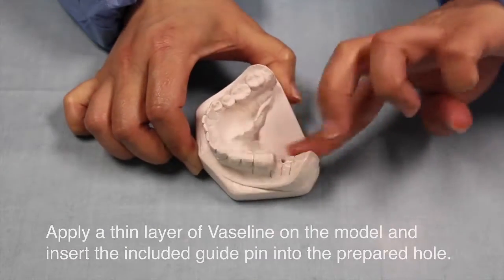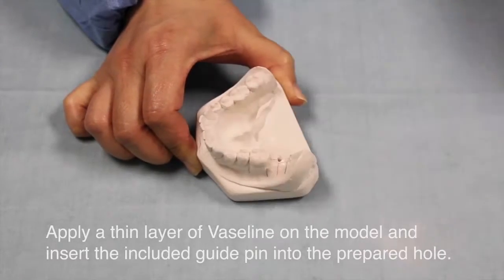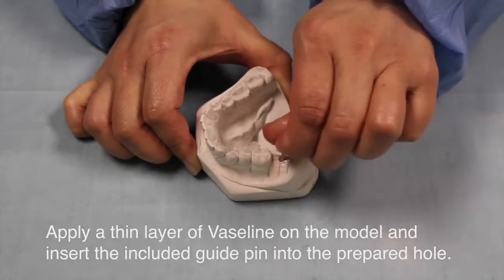Apply a thin layer of Vaseline on the model and insert the guide pins into the prepared holes.